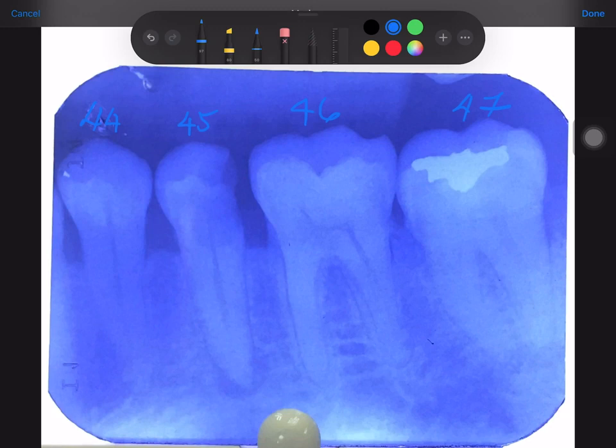Let's start with the crown of 4-5. We can see a radiolucency involving the enamel and dentine. If you trace out the radiolucency, it's a large radiolucency — so what is it? Caries.